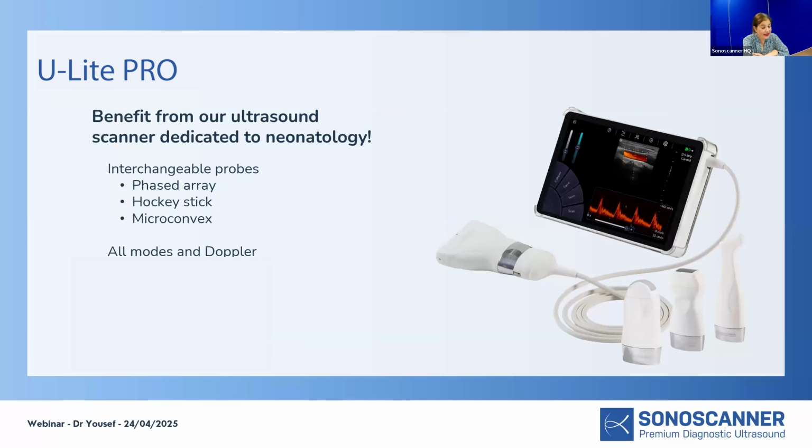Ayuk Joanna is asking, Joanna, hi, nice to see you online. Wondering whether the adult convex probe could be used in neonates, because in the low resource areas where she's practicing, there's no access to the neonatal probe. I would say that theoretically speaking, it should not really work, but I have tried it in a very low resource setting, and it did.